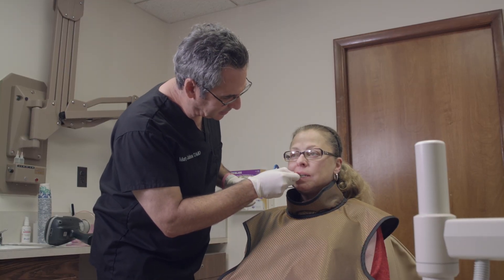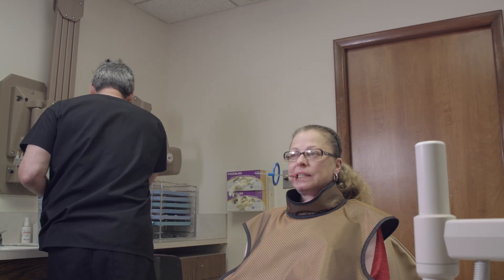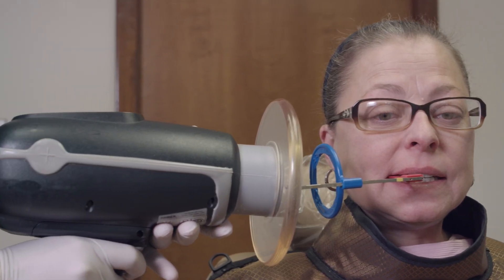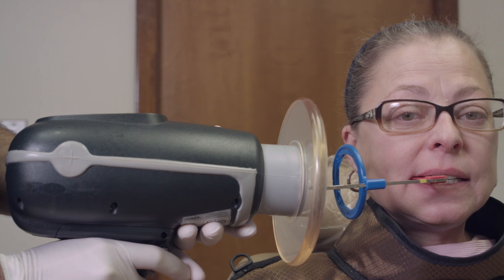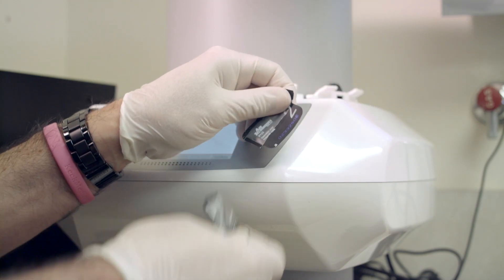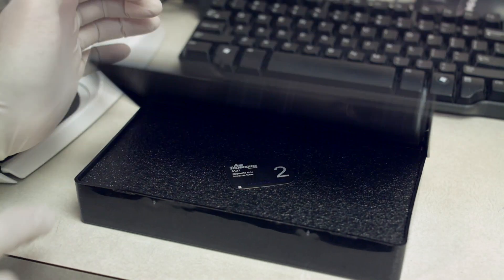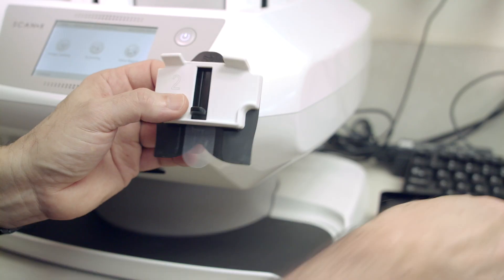The digital workflow mimics film training, so it's easy to learn and simple to use. Many patients feel that phosphor plates are more comfortable because they're less rigid and smaller in their mouths. Compared to other technologies, phosphor plates allow you to use size zero through size four — it's not one size fits all.